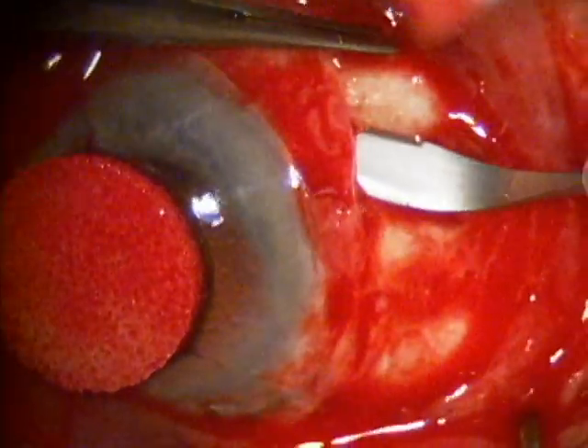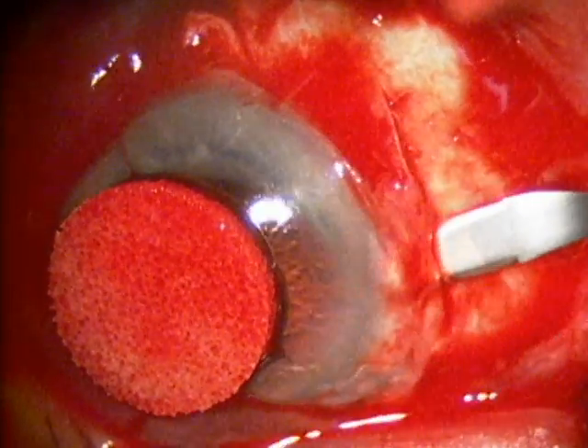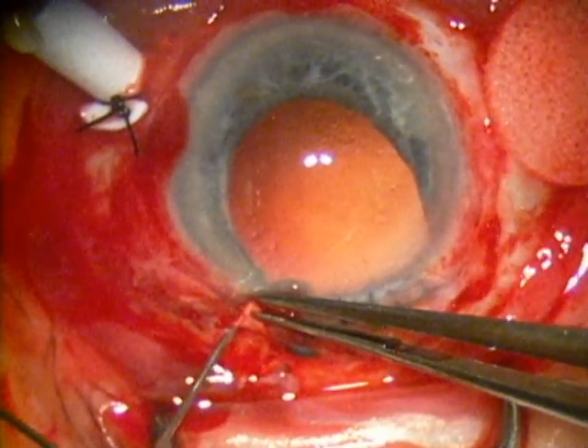On the right of the screen, you see a scleral flap being made for future insertion of the posterior chamber intraocular lens.